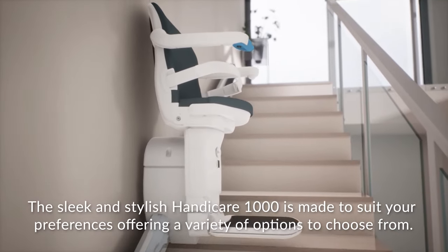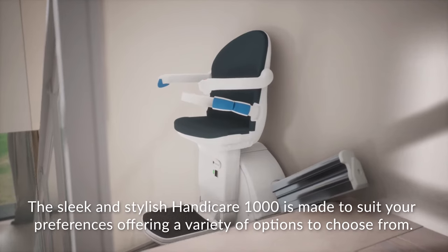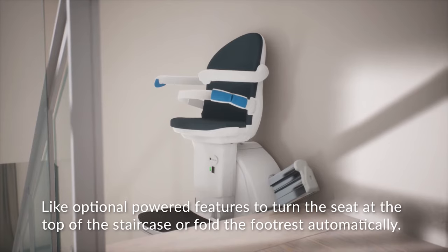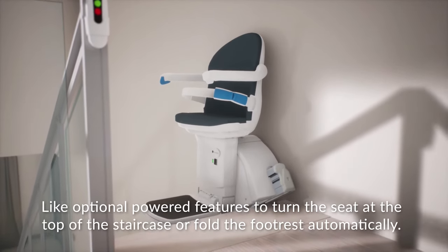The sleek and stylish HandyCare 1000 is made to suit your preferences, offering a variety of options to choose from, like optional powered features to turn the seat at the top of the staircase or fold the foot rest automatically.